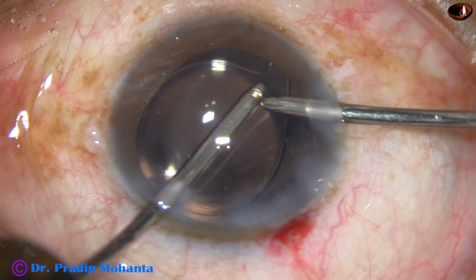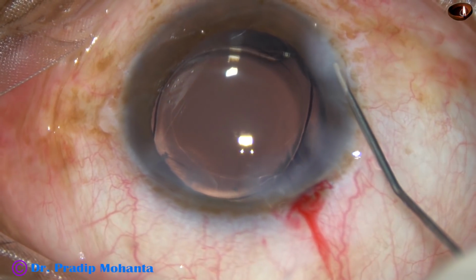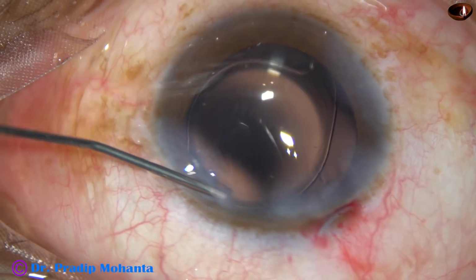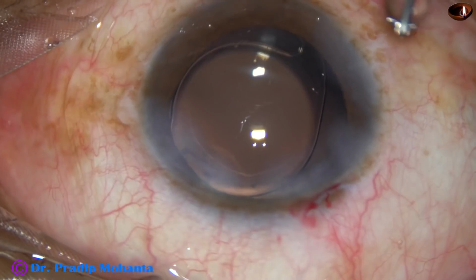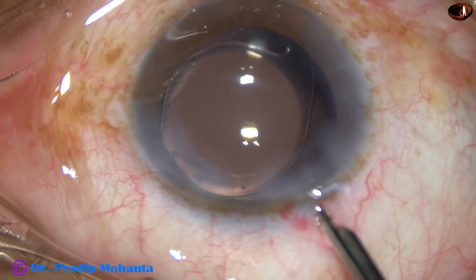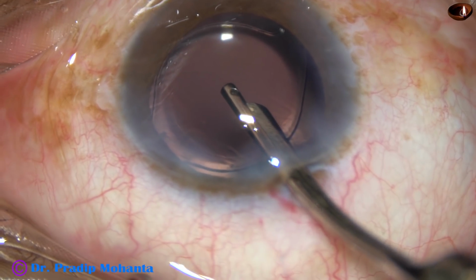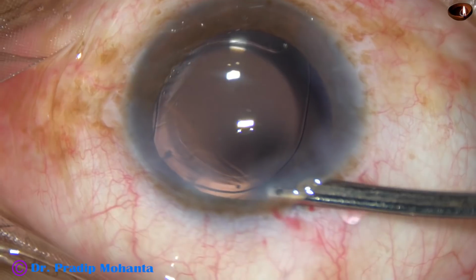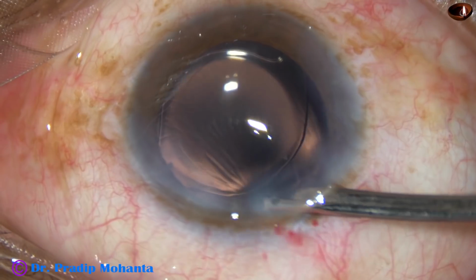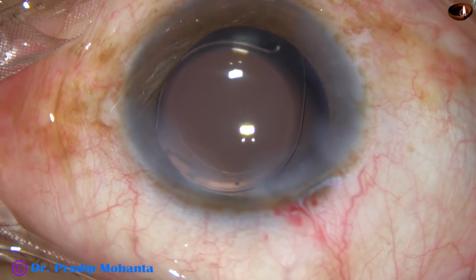And now this is some more cortical cleanup from 7 o'clock. And now the side ports are hydrated so that these stab wounds close. My main incision is in such a way that it doesn't need any hydration most of the time. This is the final lavage of the anterior chamber. I form the anterior chamber always with a Simcoe and see that the intraocular pressure is on the higher side. I check the wounds and then conclude the case.